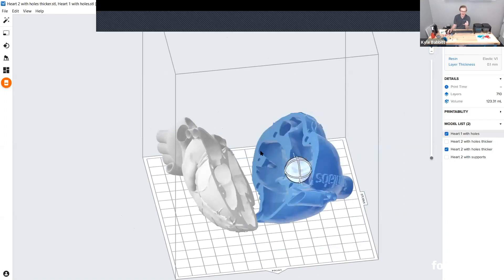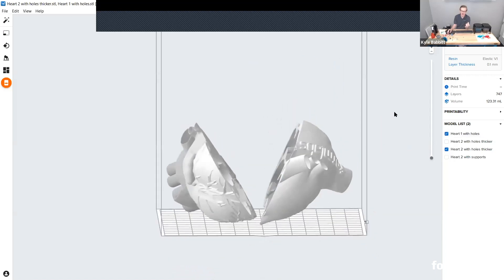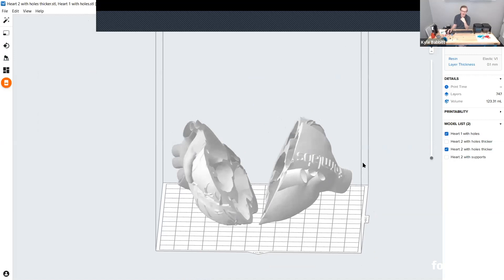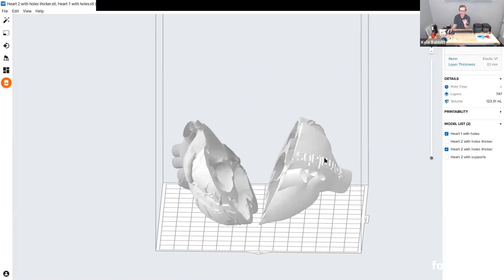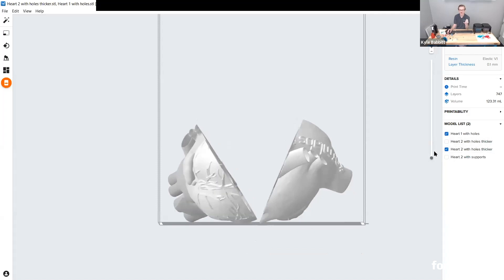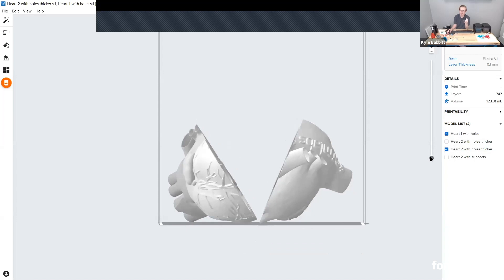If printing in elastic, you could theoretically fit both halves on the build platform. One of the key specifications for elastic material is to print it as close to the build platform as possible — the longer the support structures, the harder it is for the print to come out successfully. Since the support structures are made out of that same elastic material, they are prone to bending and moving. For elastic, you want to try to keep supports under 20 millimeters.